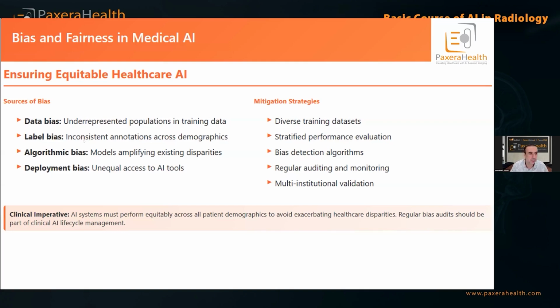Labels are again the most important thing, because if your annotation or your labels, the ground truth, are not accurate or are inconsistent, that's also another problem. We should always do a review on the labels, a peer review, to make sure that it is done correctly.